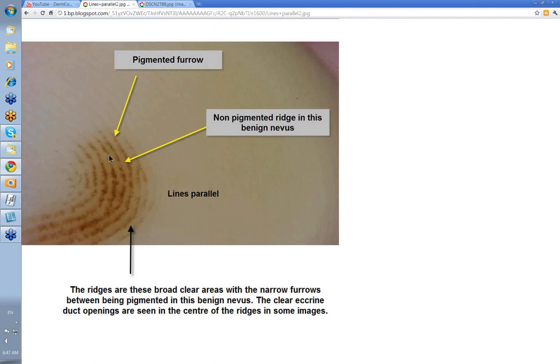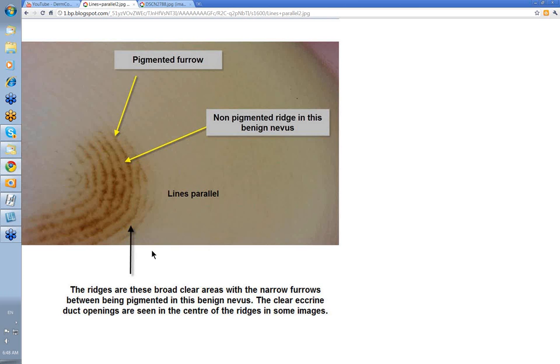Here you have a benign nevus with lines parallel — curved and parallel, as the dermatoglyphics are on the fingers. The ridges are the broad clear areas and the furrows are the narrow pigmented areas. If you look really carefully you can see some small white markings — the openings of the eccrine ducts.